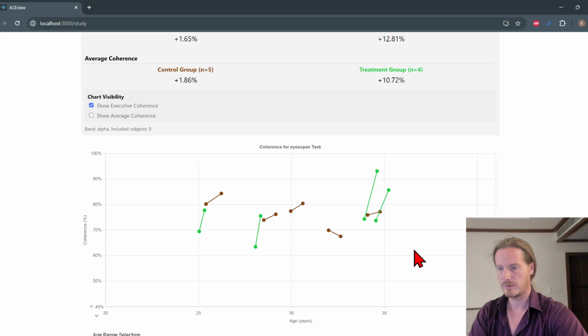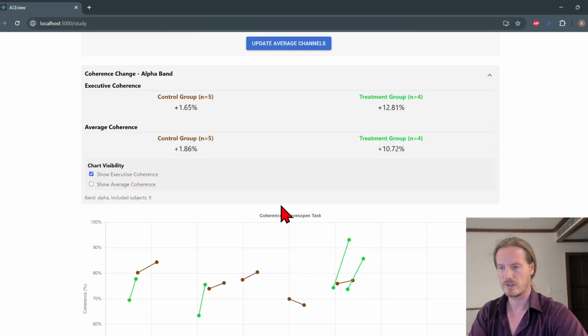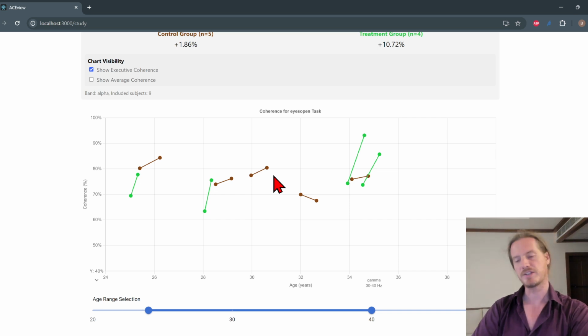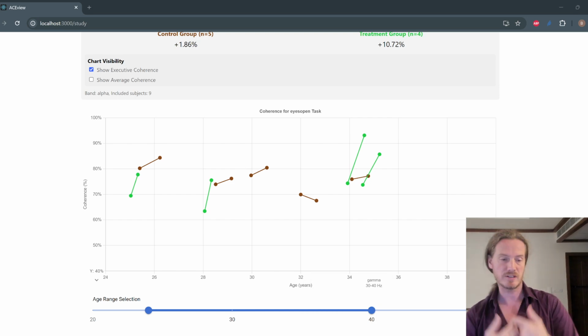And we can change here which age range we want to see. So that's another thing where we can really play with the data quite a bit. And all of this requires all of the data that we have stored already in the database. Now the thing is, and this is where things get interesting in my opinion.